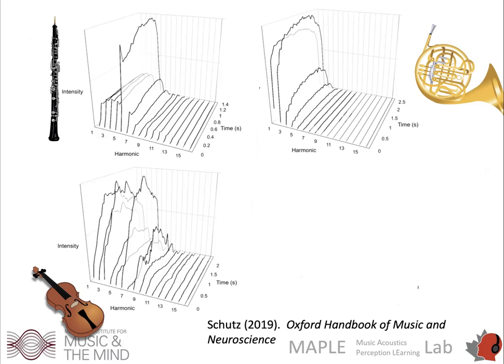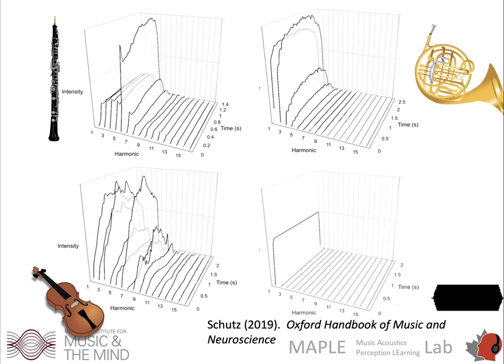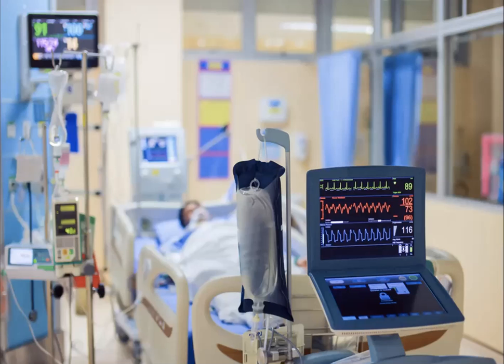I wanted to take a moment to make that point, because if we compare that with the classic flat tone that's often used in auditory research and is often the basis for these hospital alarms, we can see there's just a world of difference in the temporal complexity. Whereas natural sounds are constantly varying in their temporal structure, what we see in these flat tones is an unchanging amount of energy between when it turns on and when it turns off. The reason that's so important is because I think that's one of the primary reasons why these sounds are so annoying and so aversive.